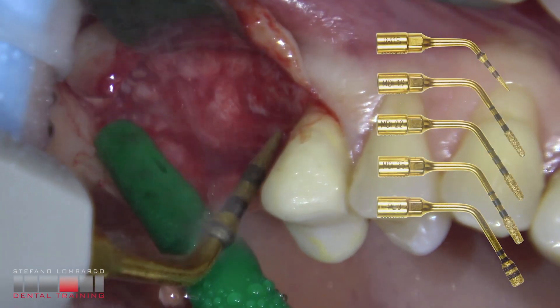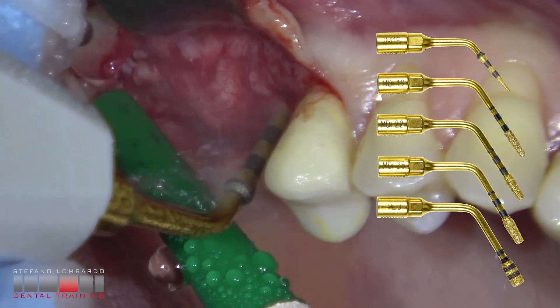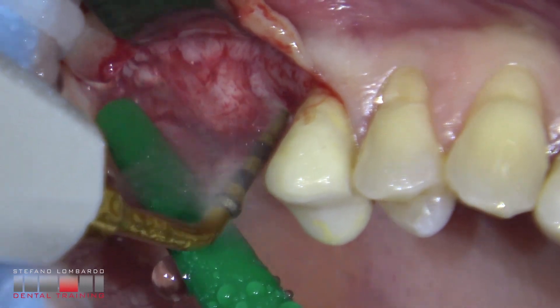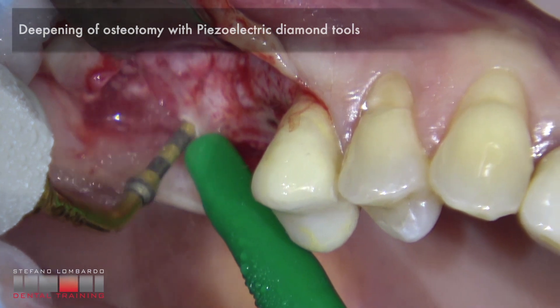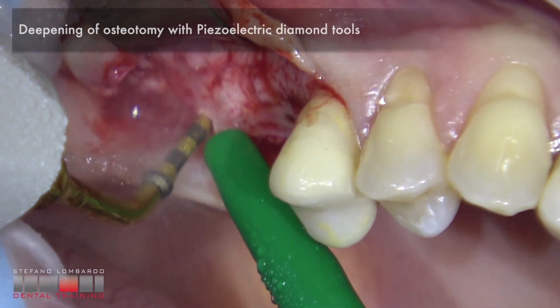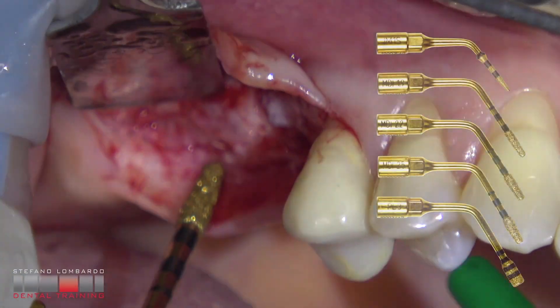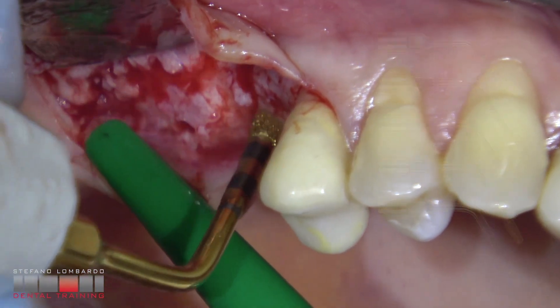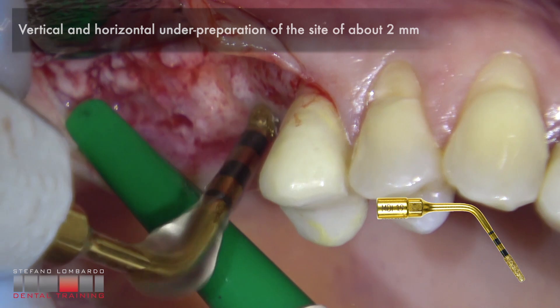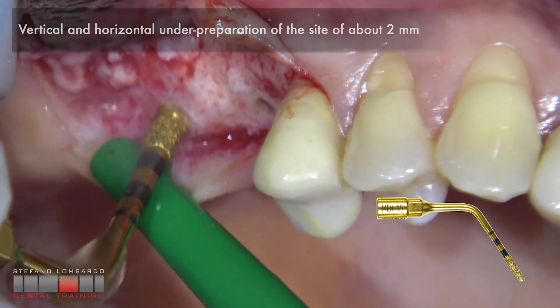Initial osteotomy of implant size with piezoelectric diamond tool. Deepening of osteotomy with piezoelectric diamond tools. Vertical and horizontal under-preparation of the site of about 2 mm.